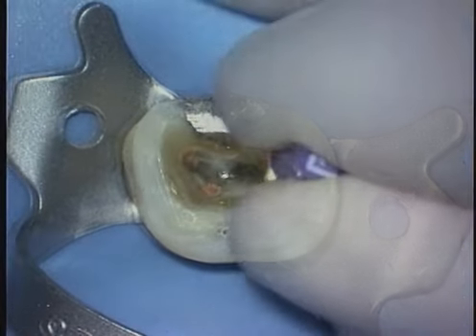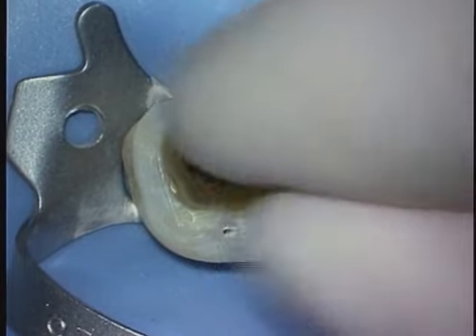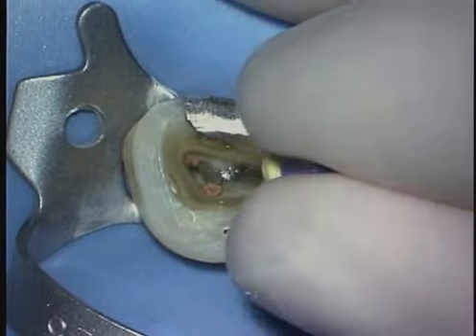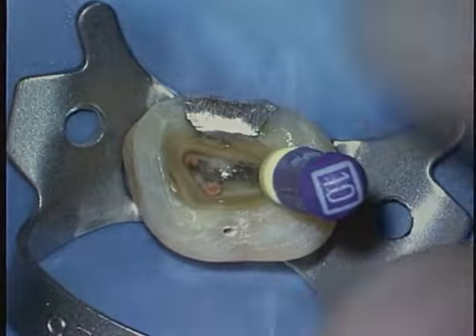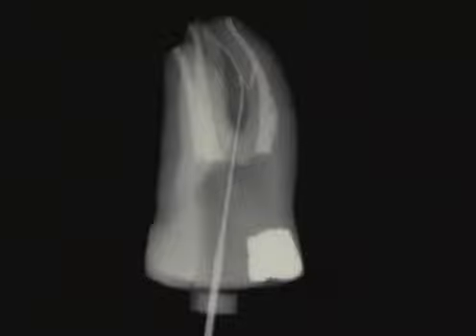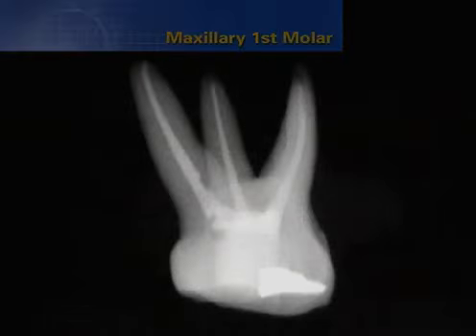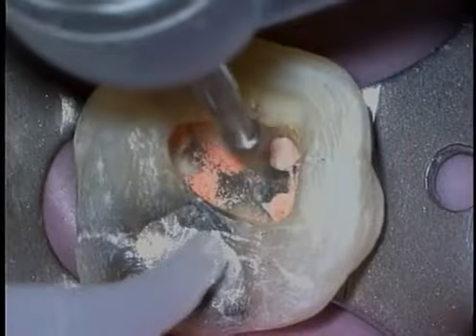Irrigate these teeth and flood them with solution. Sodium hypochlorite is a good lubricant, helps instruments slip and slide to length and negotiate canals. In the mesial angle, it would appear the MB2 is contiguous with the MB1, but the distal angle shows that it's separate over length. In this lone view, this maxillary first molar appears to have 3 roots.